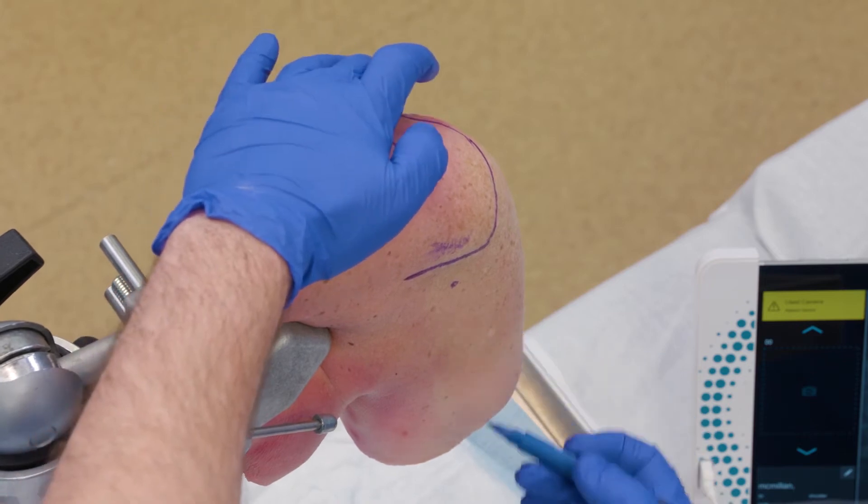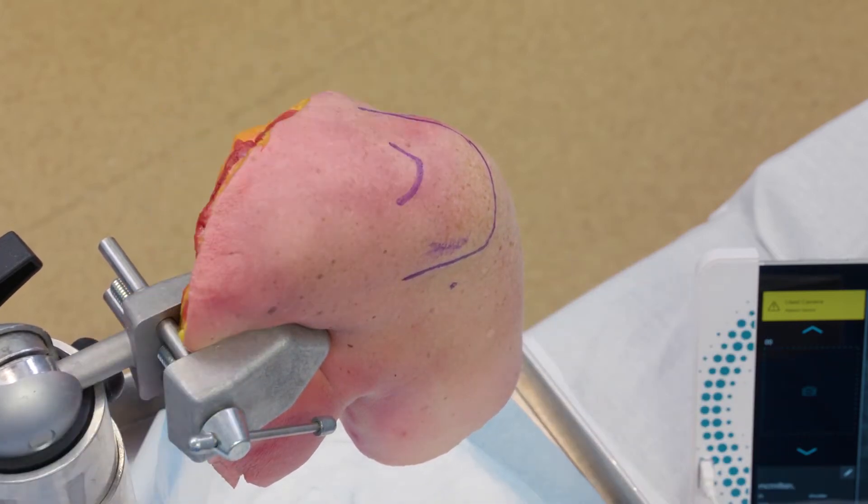You want to come in and aim just for your coracoid. Once I mark this out, I'll anesthetize the skin. Just like with the knee, I want to anesthetize any portal I might actually use.